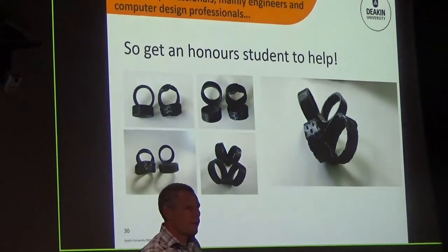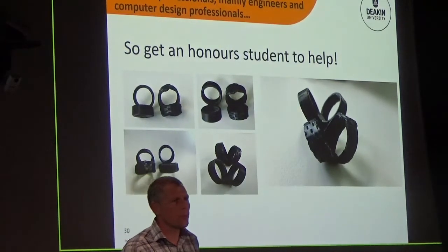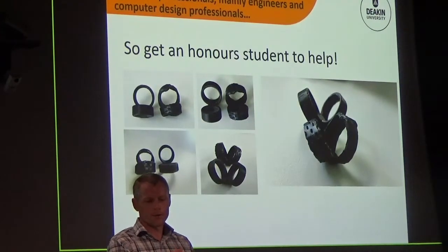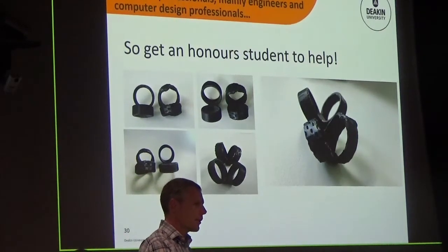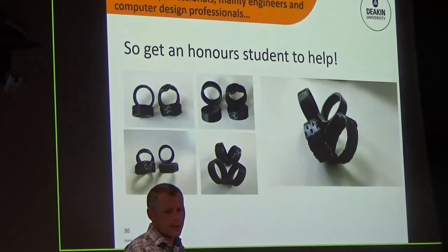So with that, the area of 3D printing and additive manufacturing is very much, as I showed, lots of people doing work, particularly over the last year or so, but pretty much everyone's an engineer or computer design person. I thought that's good, but not many health professionals are in this space. So I thought a better thing to do is get an honours student to help me out. So as you see through those splints that are curling around at the moment, we've got a 3D printed splint and we've got a thermoplastic splint.